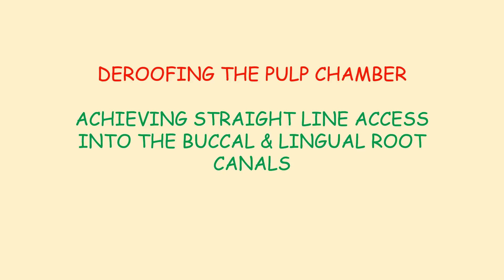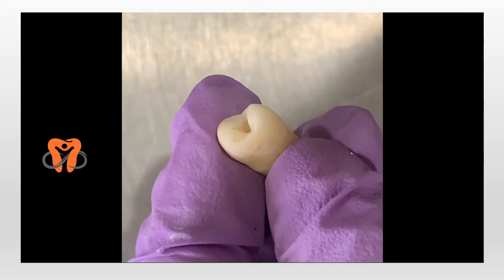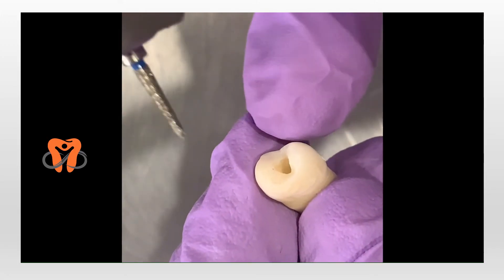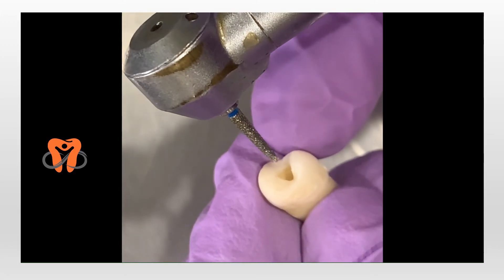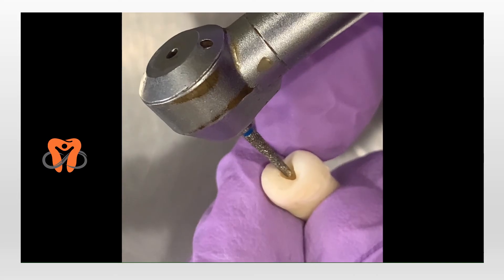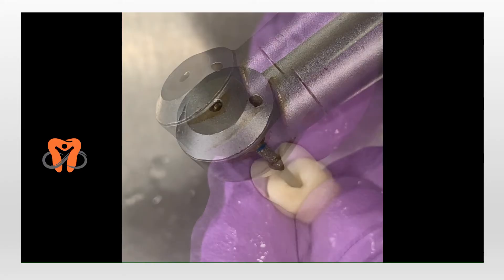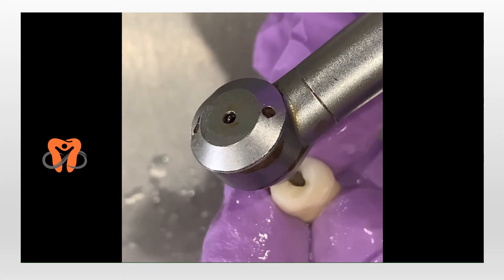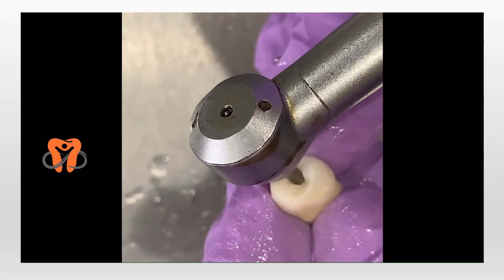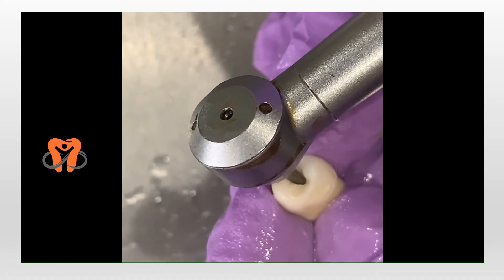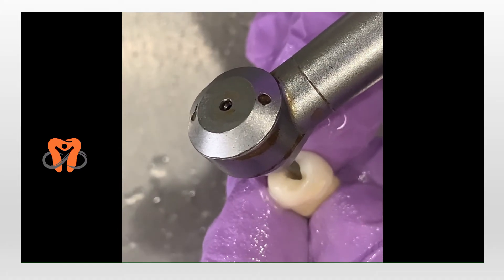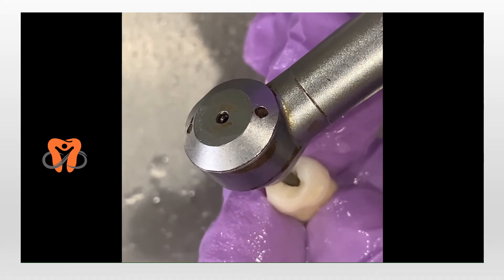After entering the chamber, the next important step is de-roofing the pulp chamber and then achieving a straight line access into the buccal and the lingual root canals. To de-roof the pulp chamber, I use a tapered cylindrical burr. The most important thing here is that while I cut, I maintain the depth of the burr. If I do not do that, I will cut deeper and cause perforation. I move the burr in the buccal and lingual direction alongside the walls of the pulp chamber so that I'm able to de-roof it completely.